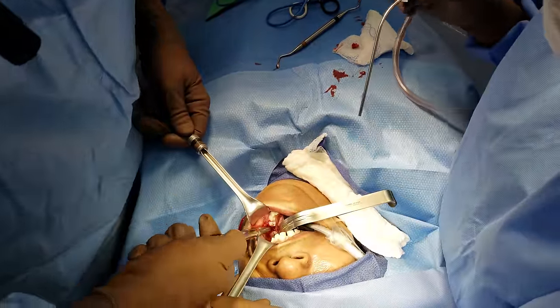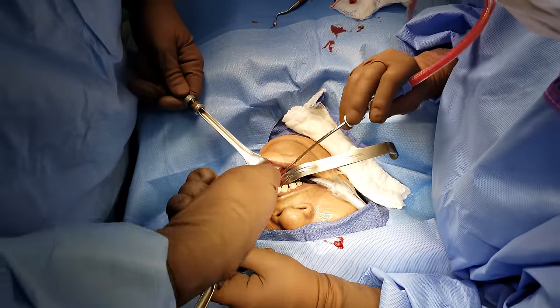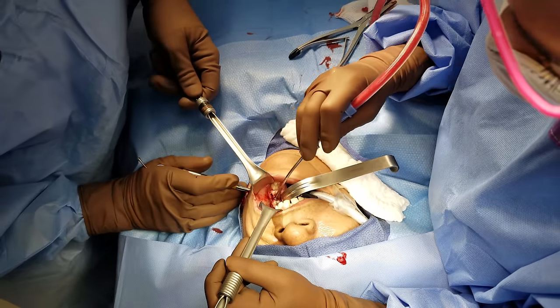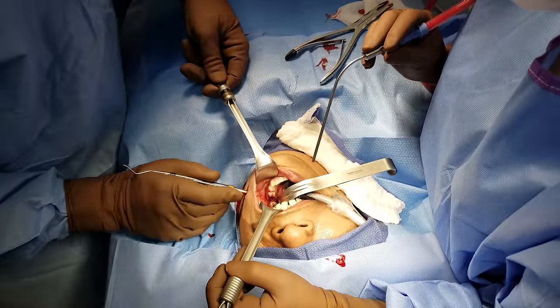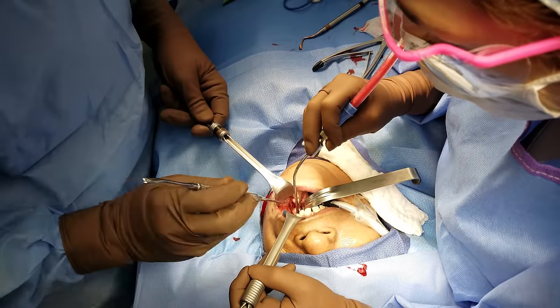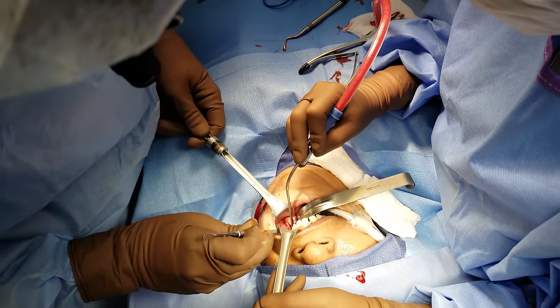That's just a big periapical granuloma growing off of the infected tooth. Okay. Now, I think we can see here, see the instrument? So that abscess just tracked right from the tip of the root out through the skin. Let's take off this back broken one. I don't think it caused the infection, but we're here. Let's get rid of it. It's not helping.